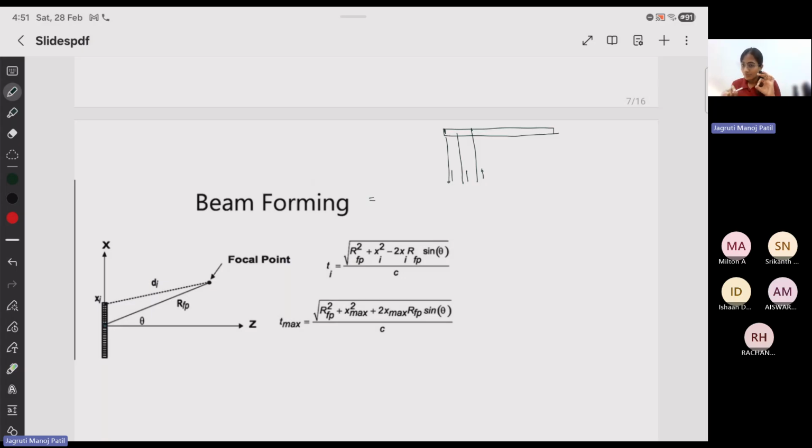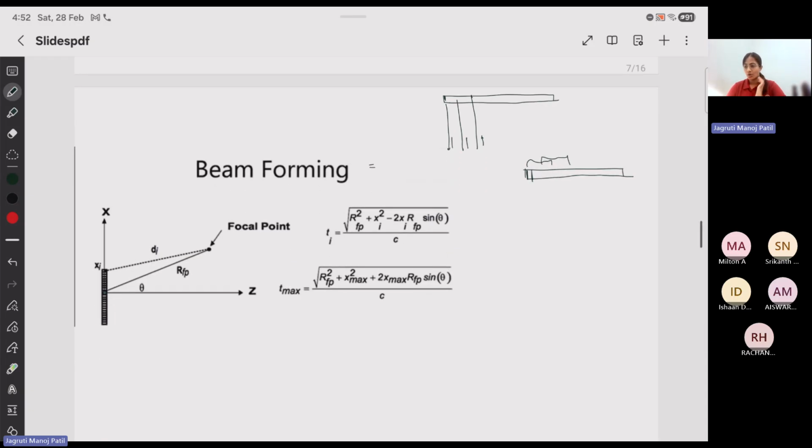Okay. So this is something based on hardware complexity, and beamforming is something that you do in software. How they do it is that they send using one element, however they receive using a group of elements, which can be on the order of two. Again, they shift the aperture using another element and group again. But this method also after a point didn't work out, and the SNR was being lost when you were trying to image deeper organs.